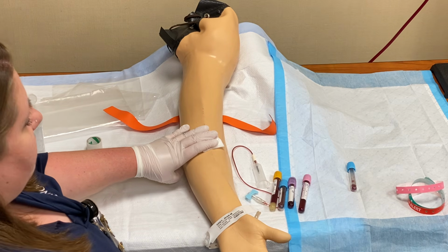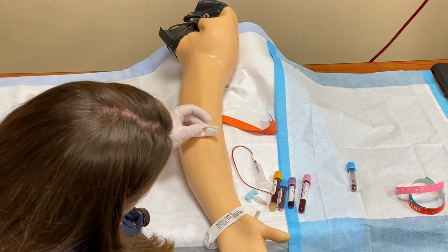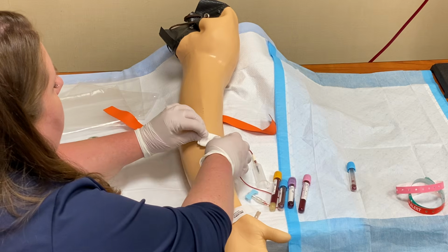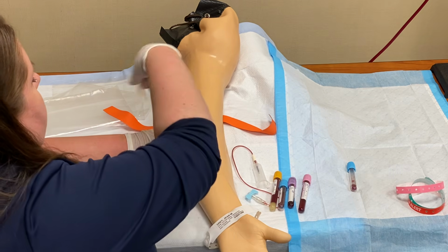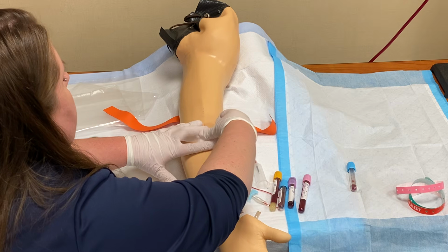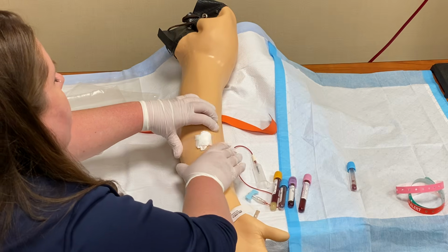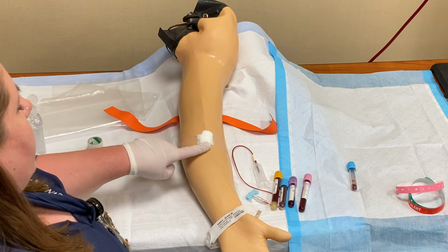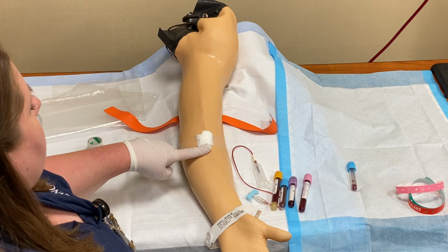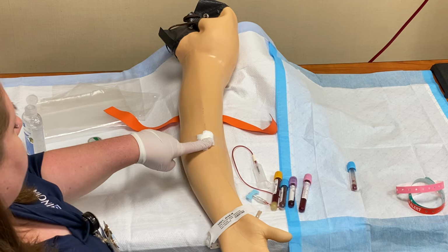So it's been about 3 to 5 minutes. Once I think she's finished bleeding, I'm gonna make sure I check, and if she's not bleeding anymore, I'm going to tape down this gauze. If I notice that she's still bleeding, I'm gonna continue to hold pressure until the bleeding has stopped. If I don't wait till the bleeding is stopped, when I come back in to check on her later, there's a high chance she's gonna have a bloody arm and she's gonna develop a bruise right here. So I wanna make sure I'm holding pressure.